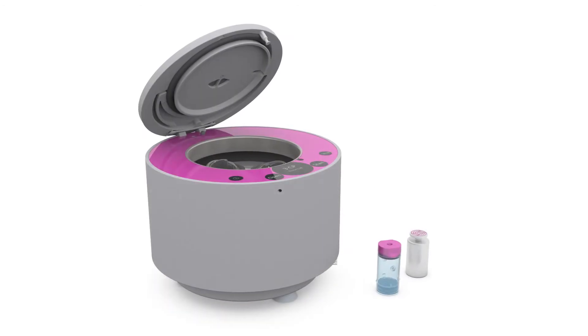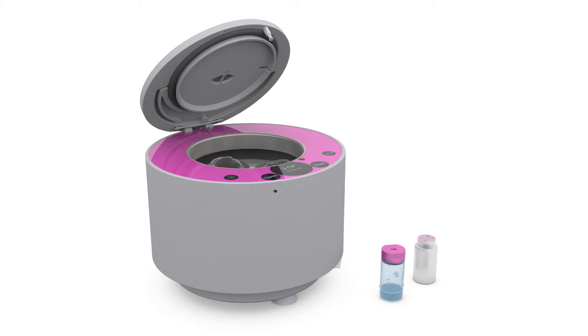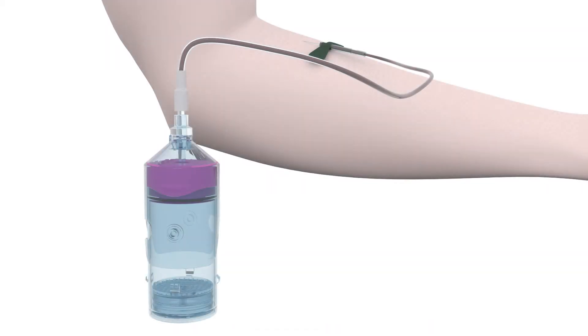The REAPLEX 3C patch system holds a key to wound healing. The personalized 3-step system reformulates a small sample of the patient's blood into a patch to be applied directly to the wound. The patient's blood, containing immune cells, platelets, and growth factors, is collected into the device.